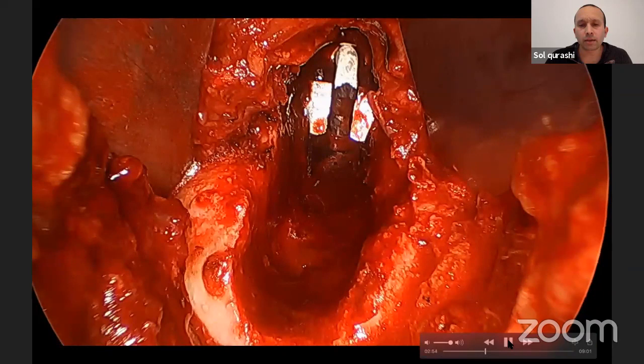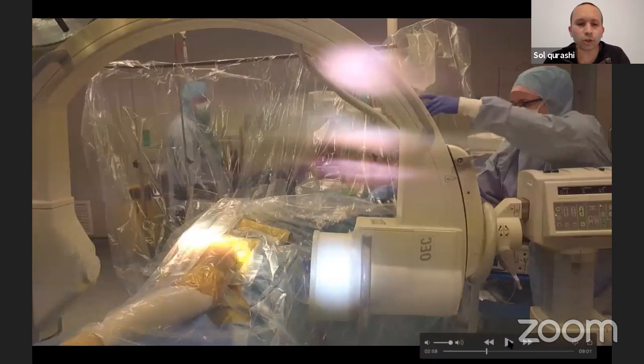And so it's very easy to get the II. You just put the IIC arm over the top. We'll put a couple of plastics on the hip. One or two shots, and that's it. And there you go.